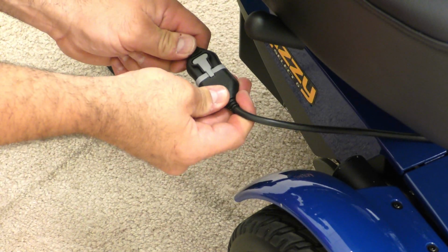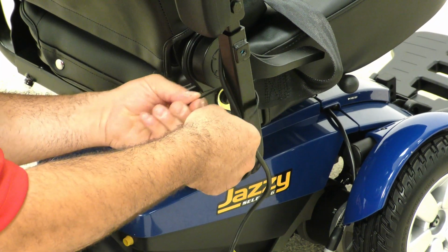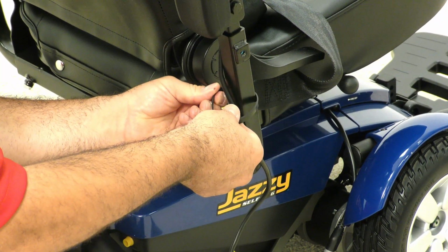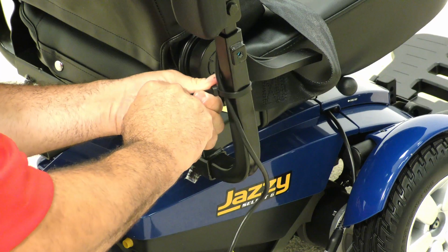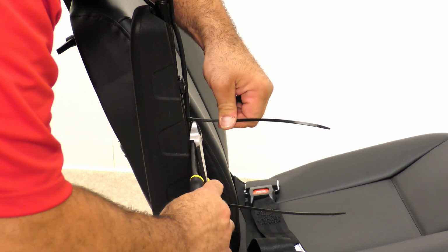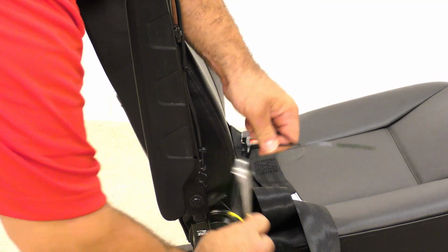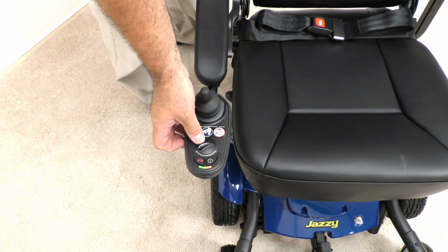Connect the joystick 4-pin connector to the power module connector and finish securing the harness to the armrest. Note: always have the armrest in the upward position to ensure there is enough slack in the harness. Cut off the excess wire tie ends flush so that there are no chances of the end user being scratched or cut. Turn the unit on and test for proper operation.